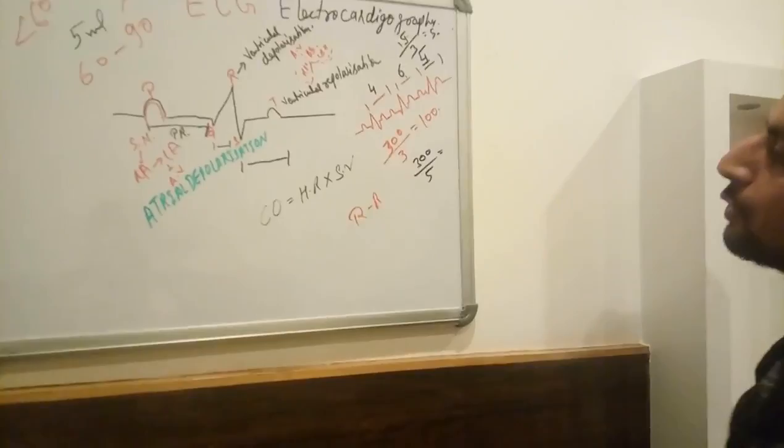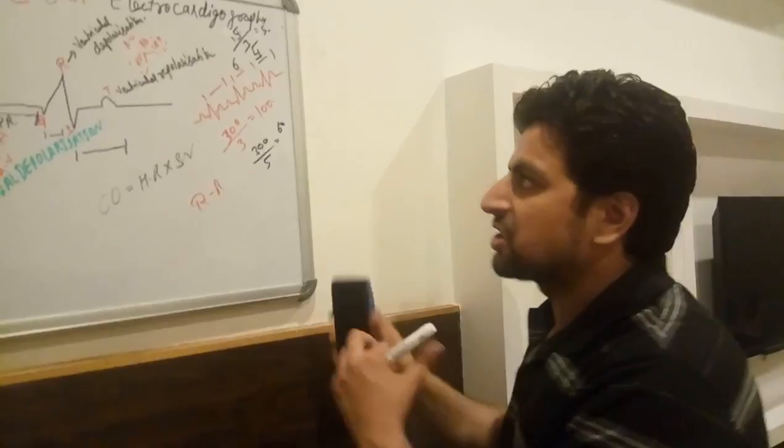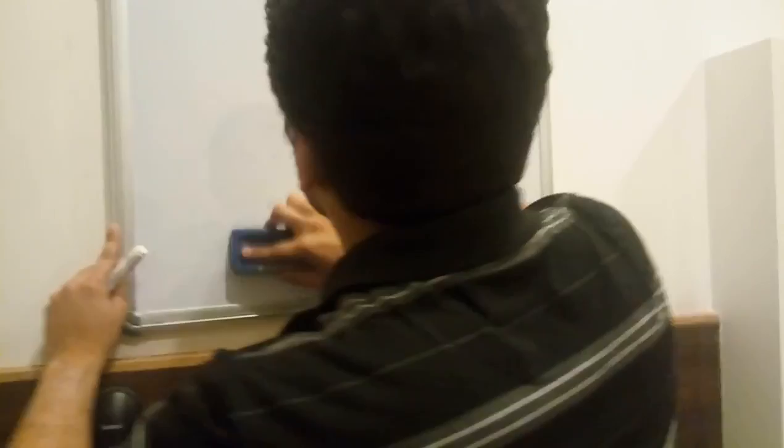Okay, another example I am going to give you. This is another way. I hope this is not too congested, it's not looking good. So I am going to wrap all this up and explain to you very easily how to calculate the heart rate.